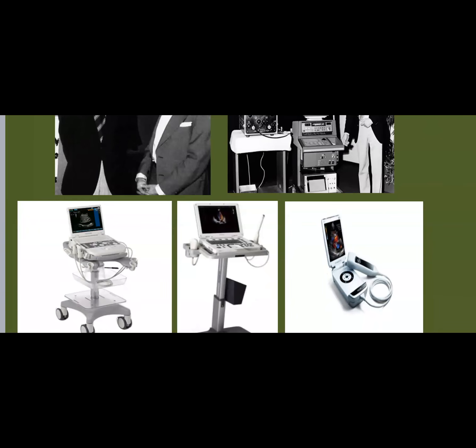So now we are talking about even the handheld and the mobile software you can download, and the probe you can connect to your mobile, and you can use it just like a stethoscope. So echo is going to be POCUS, which is point of care ultrasound, just like a clinical exam tool.